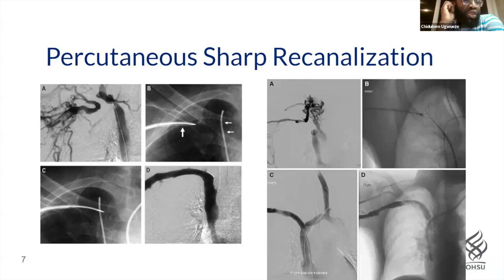In addition, this is usually a majority fluoro guided case, because you still need the fluoro to do your venogram, wire actions, catheter actions, deploy your stents, etc. You would need a hybrid room with a CT and a fluoro angio suite in the same room, so that you can do your CT guided access, and then wheel the patient back to do the fluoroscopically guided parts of the procedure.